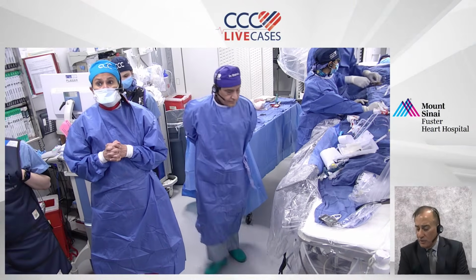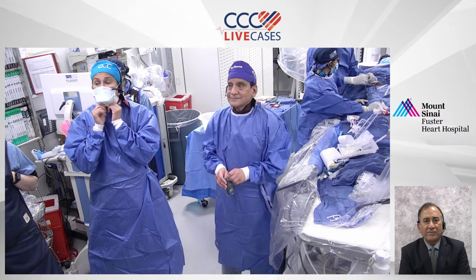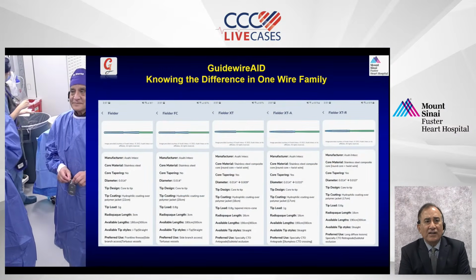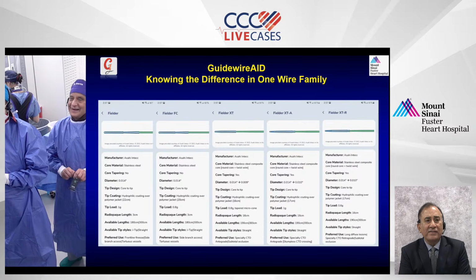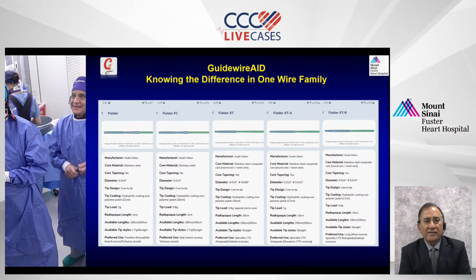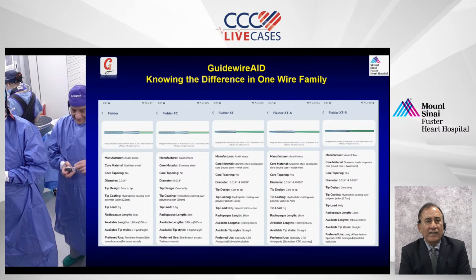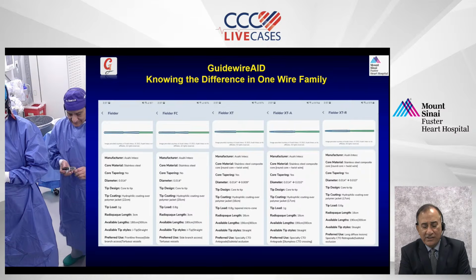Yes, some observations. Crystal clear, towards the beginning of the case you mentioned, I will answer the Impella later, loud and clear. And that really is the purpose of our being guided for the cases by the available clinical data. So outstanding. Anu, beautiful skills, great judgment.